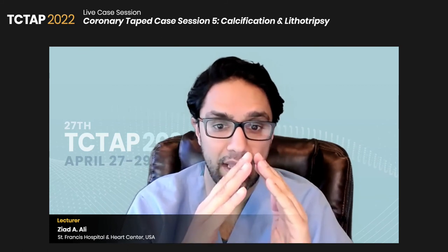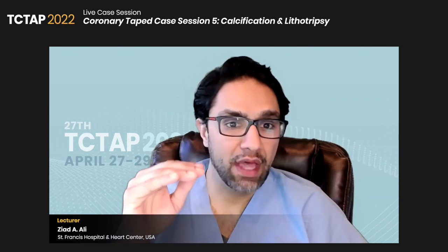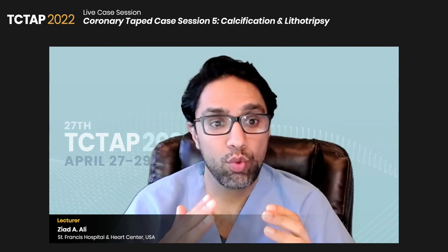The third type is the most difficult, and that is the glacier. The calcium is coming and peaking all the way from the base and is very thick, typically more than 1 millimeter. There is no good therapy for that because, as Antonio showed very elegantly, unless you use an extremely large burr, you will only cut the very peak off of that nodule. So as soon as you put your stent in, the nodule will tend to bias again towards the stent and either pop through it or create a restenosis and recoil.